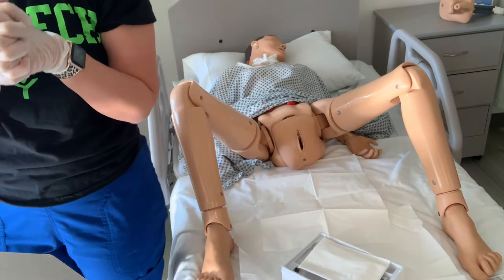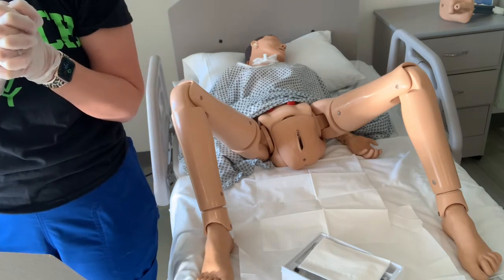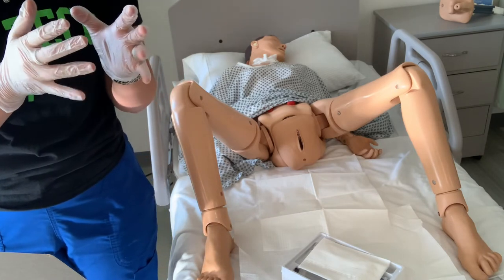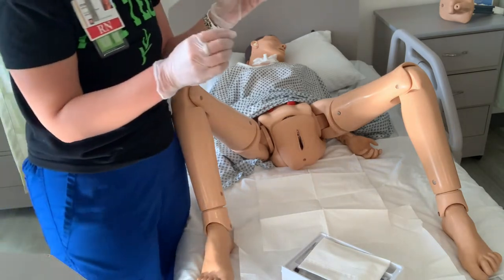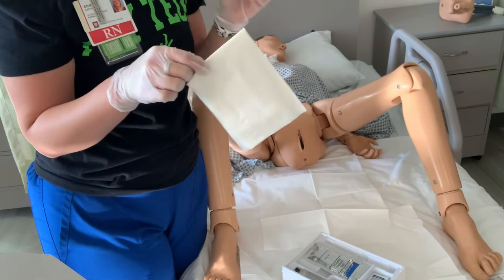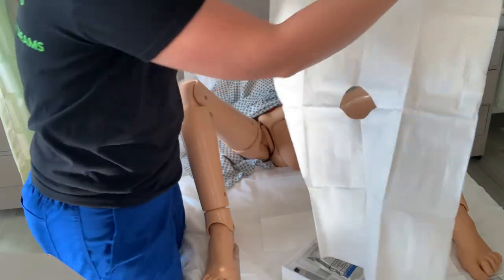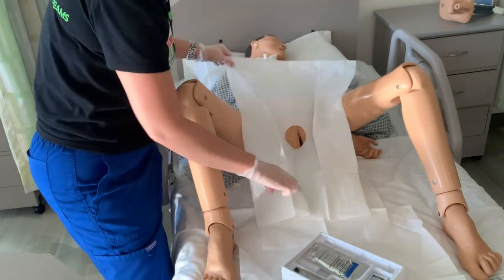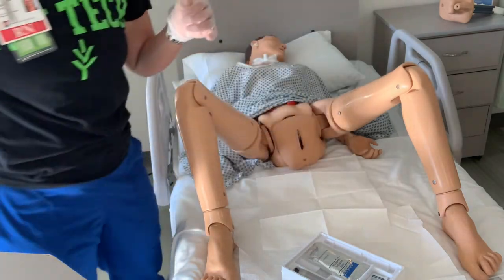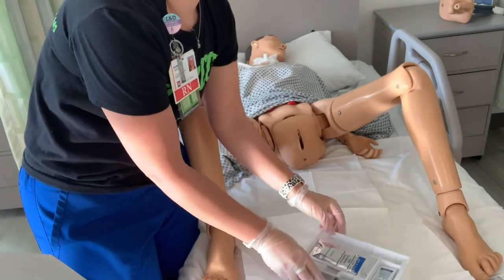Keeping our hands above our waist, the next thing we're going to do is attach our pre-filled water syringe to our catheter and then carefully remove the wrapping off the catheter and lubricate the tip. There's a fenestrated drape — I don't use it personally, but you can if you want; it just goes like this and exposes the opening, which extends your sterile field. I can touch anything in the kit with my sterile gloves — anything but the patient, because once I touch the patient with my hands, I'm contaminated. First, we attach our water syringe, which is what we use to blow up the balloon to keep it secure. If you forget this step, it's hard to attach later because you're only going to have one sterile hand.